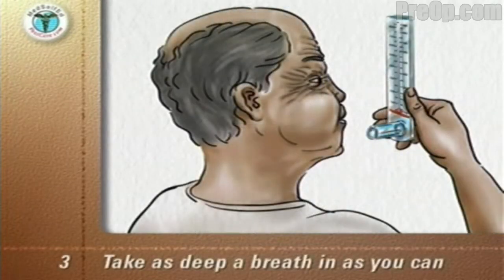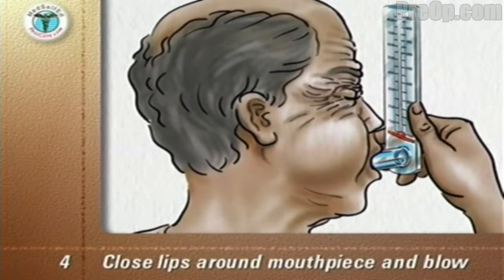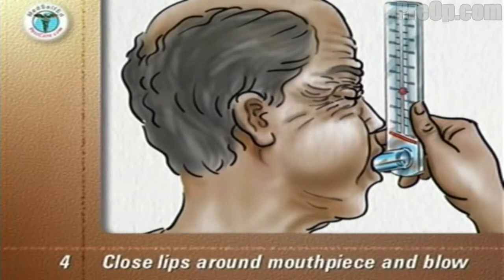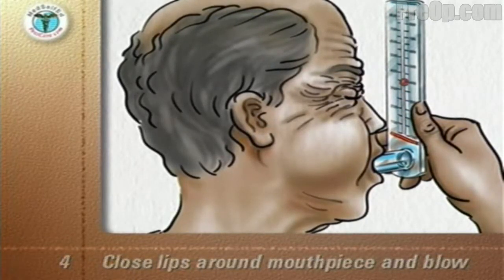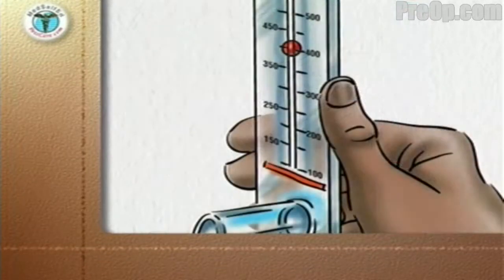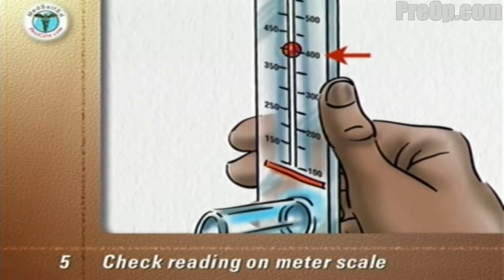Take as deep a breath in as you can. Close your lips firmly around the mouthpiece and blow out as hard and as fast as you can, just like blowing out candles on a birthday cake. Check the reading on the meter scale — in this case 400 liters per minute — and write it down.